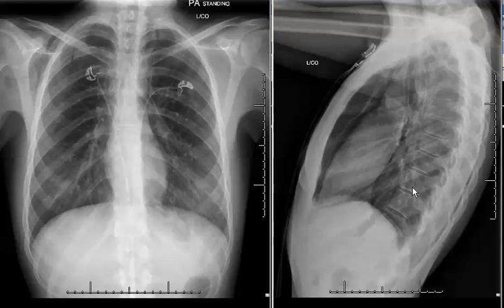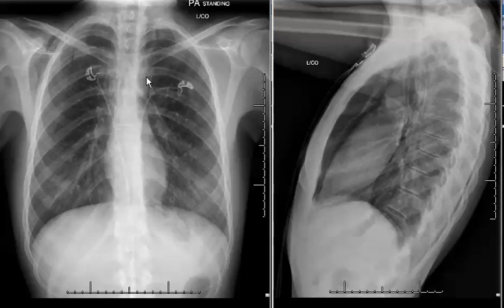The findings of pneumomediastinum can be very subtle on radiography. Oftentimes the diagnosis is better assessed on the lateral view by seeing air outlining the anterior and posterior aspects of the heart. One should also look for pneumomediastinum outlining some of the other mediastinal structures, such as the aortic arch here.